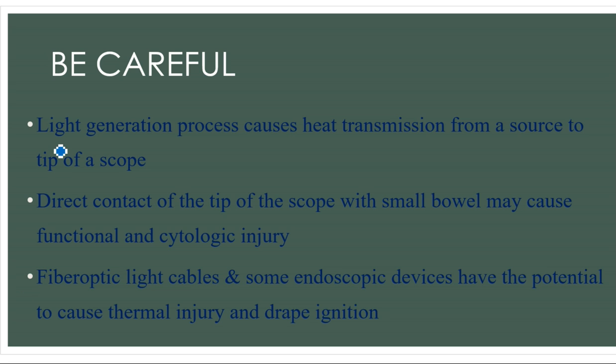Remember, the light generation process always causes heat transmission from a source to the tip of the scope, and direct contact with the small bowel may cause functional as well as cytologic injury, right? The cells of the bowel, whenever you are touching the scope over a small bowel, you may not notice the injury.